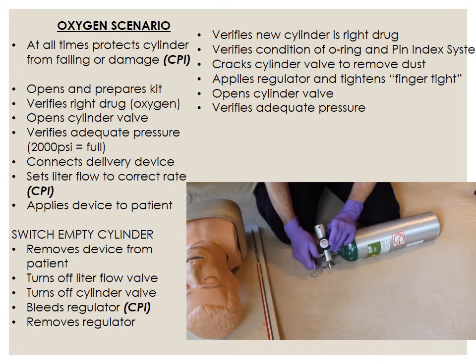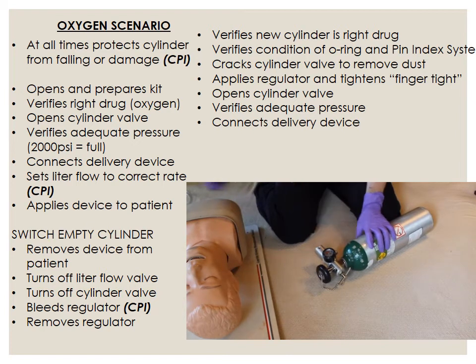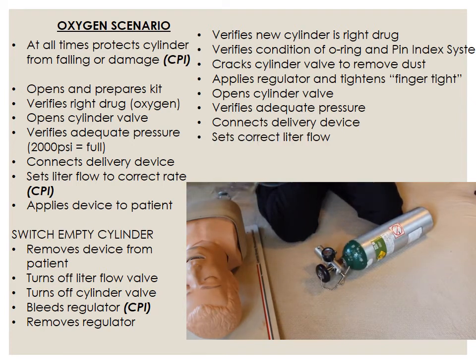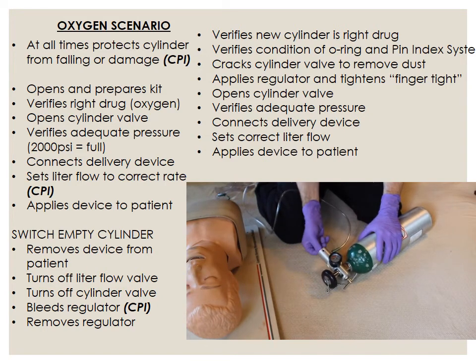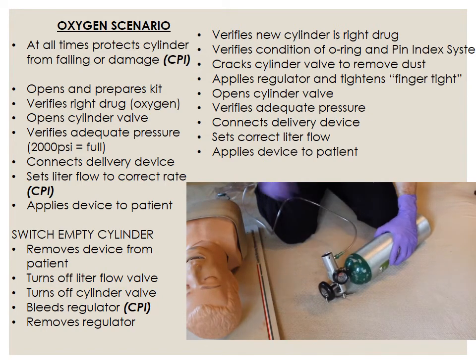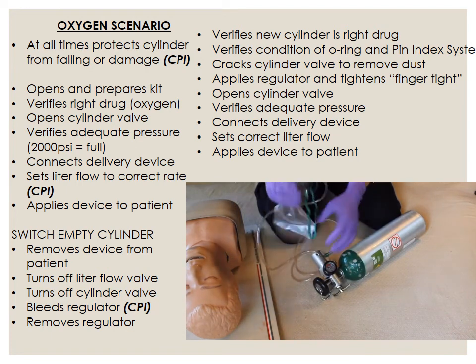Open the cylinder valve using the wrench. Verify there is adequate pressure. Connect the delivery device. Set the correct liter flow. And apply the delivery device to the patient using correct technique.